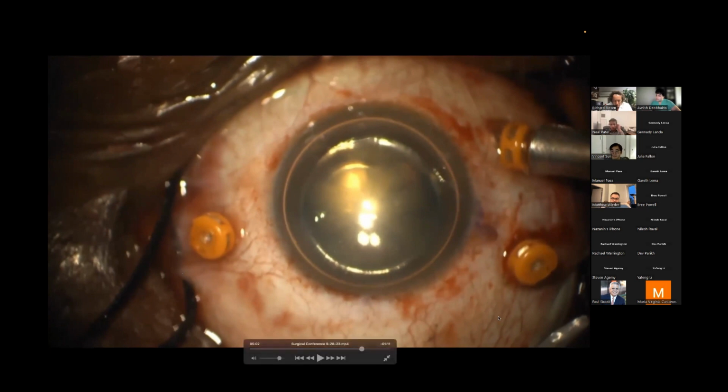Sometimes when you have this bubble, it makes your vision even better, especially if you do longer surgeries, it somehow improves your vision. It happened to me when you have these perfect bubbles that fill in the whole anterior chamber. Actually, in this case, you need to do a fluid exchange or something. It makes a better view, but not in this case. And again, in the beginning, it was not a bad view to the laser, right, Neal? And then it got worse. Yeah, I think it did progressively get worse. I think that was the feathering of the lens. That's what made it worse. But until that happened, it wasn't too bad.